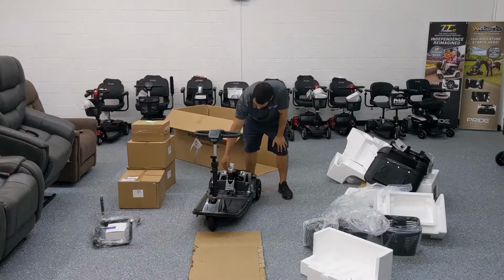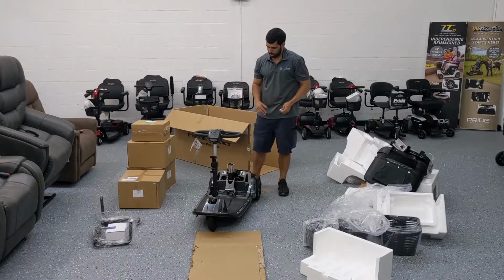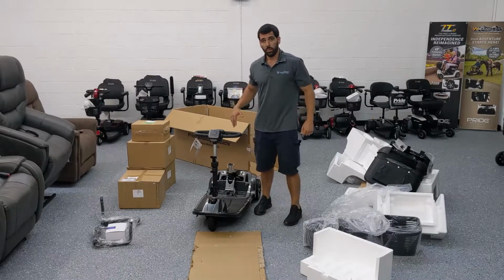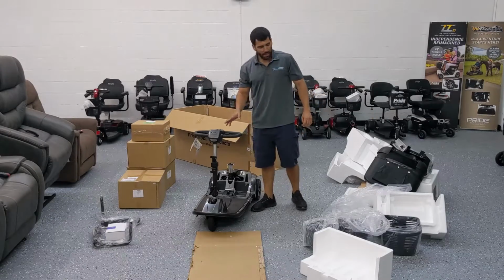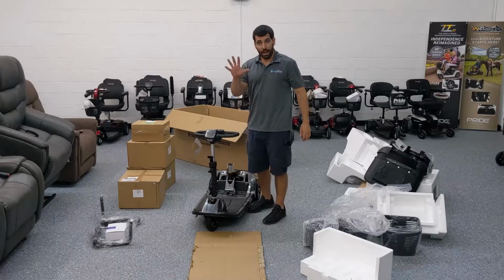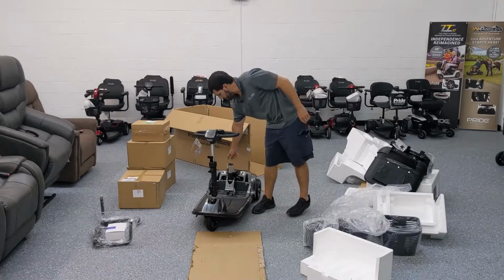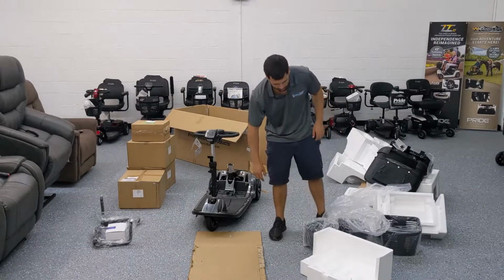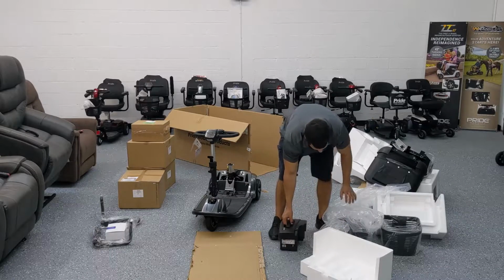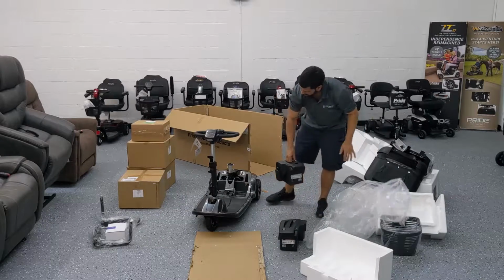It's a safety feature. Basically, what happens is if your battery dies, the brakes are still going to be on, so you won't roll down a hill uncontrollably, which can be dangerous. So just keep that in mind. If you turn your scooter on and you hear a beeping sound, 5 beeps, that means your drive lever is not in the right position and your scooter will not work. Okay, so now that we've got the scooter out of the box, let's get the batteries ready.